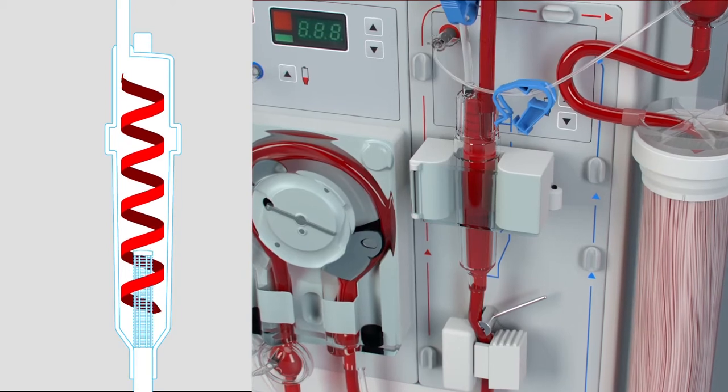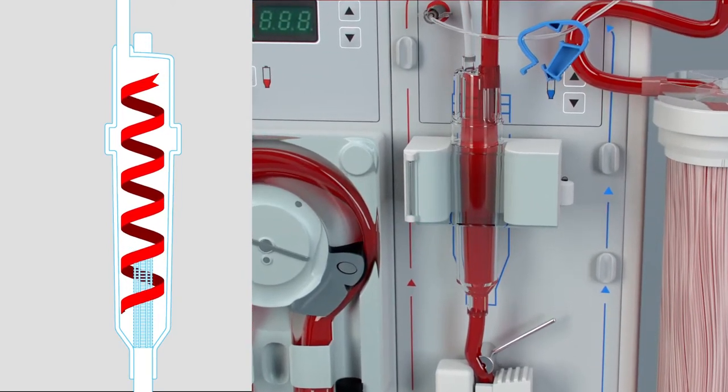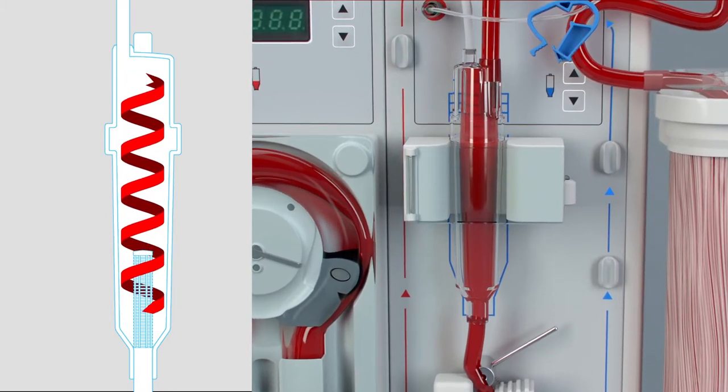Blood enters the venous vortex chamber, moving in a horizontal vortex pattern, reducing the risk of foaming, splashing, or the formation of microbubbles.